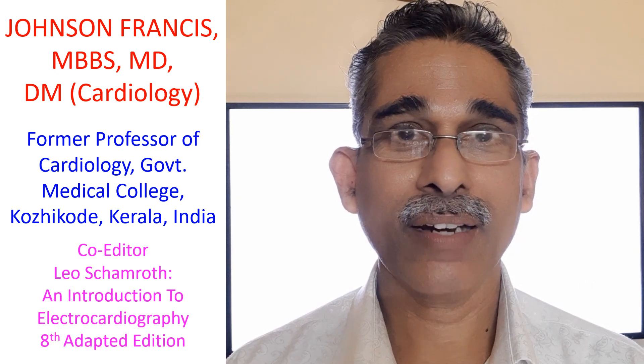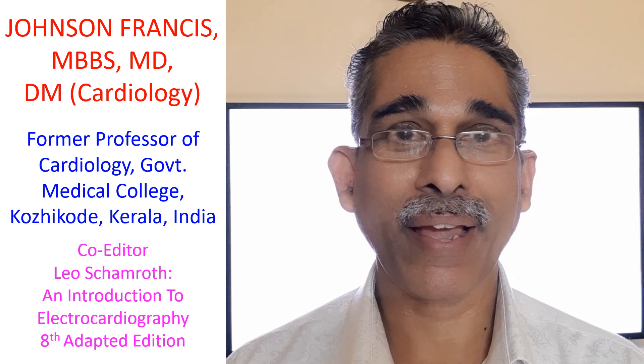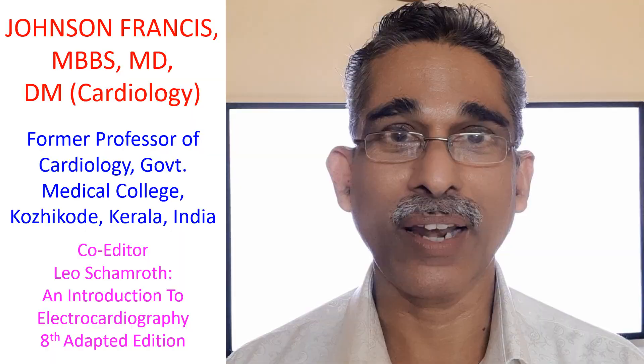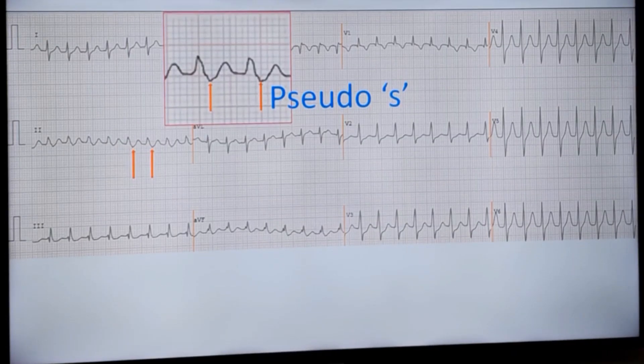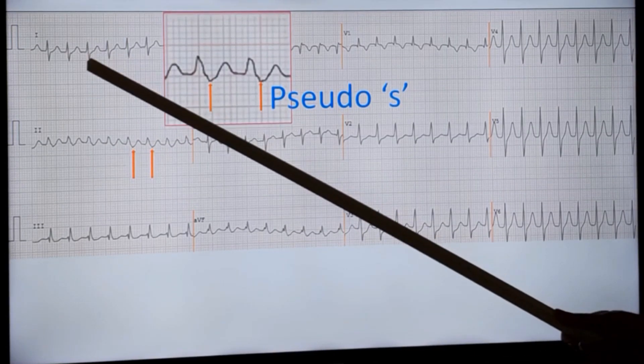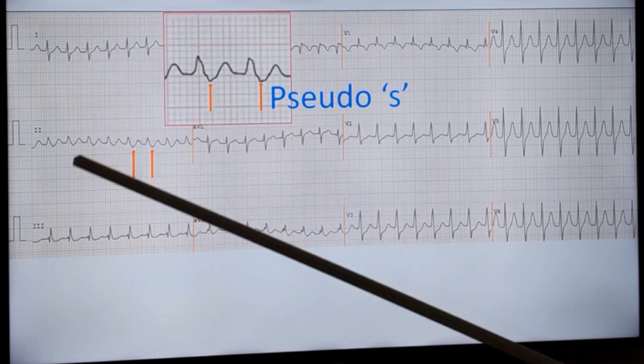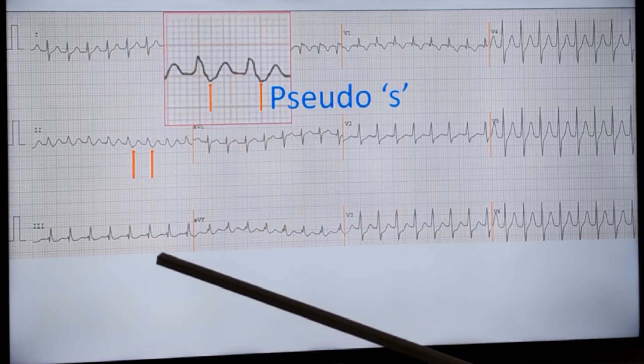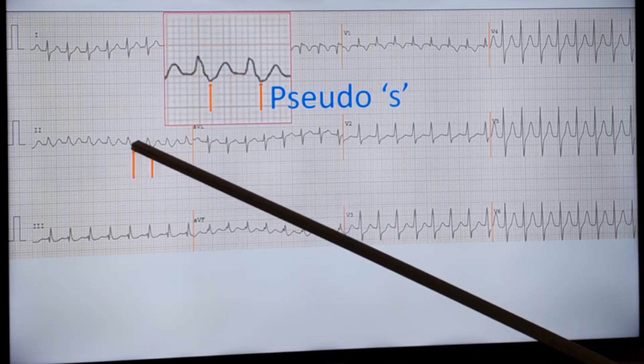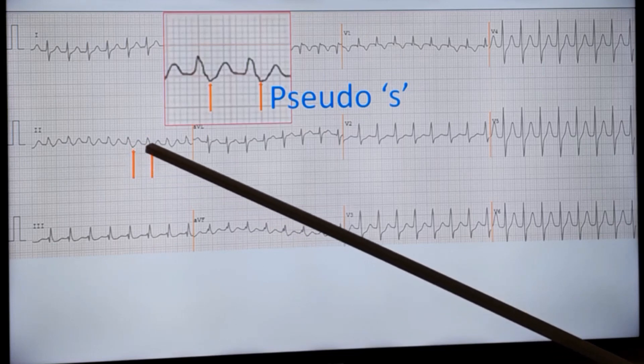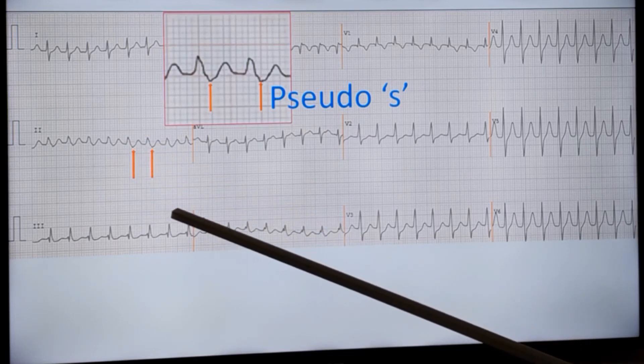Earlier we had discussed a wide QRS tachycardia. Now we will discuss a narrow QRS tachycardia occurring at a rate of about 180 per minute and see what is the possible mechanism of the tachycardia as well. Have a look at this ECG. At first glance there are no P-waves seen, but if you carefully look there are retrograde P-waves after the QRS complex.